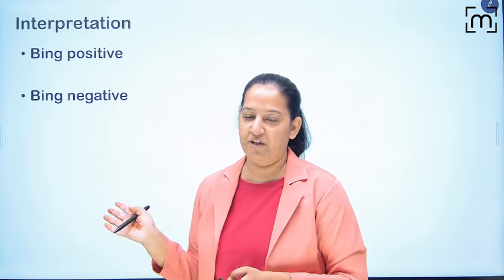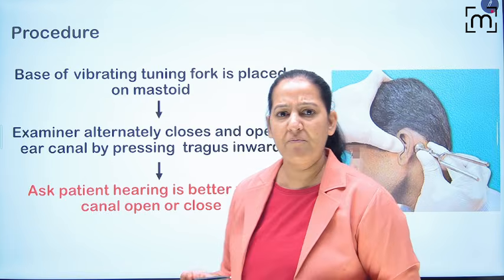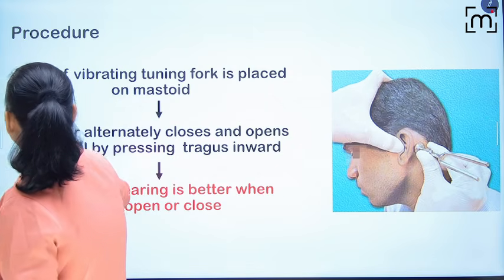Let me tell you the interpretation, then I will do it on the model. So there are 2 interpretations, Bing positive and Bing negative. You will say, ma'am, what actually happens on occlusion? Let me tell you what actually happens on occlusion.